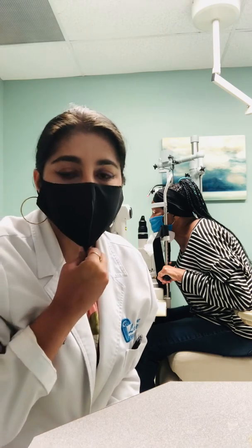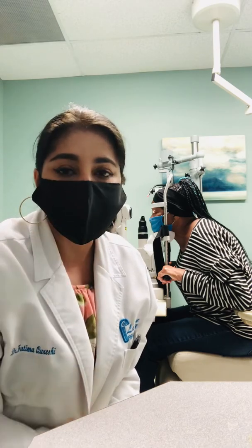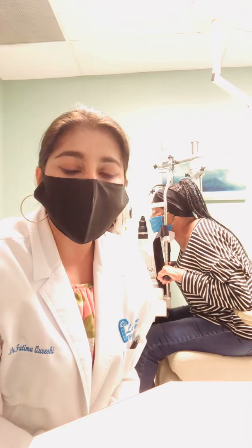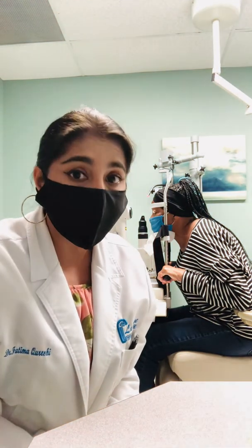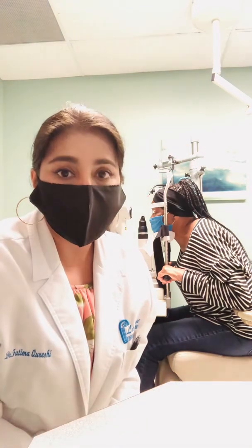This means I'm going to make a little hole in the iris so that the fluid can start draining. Then we see the patient again to make sure the pressures are under control. Sometimes you may still need to put them on glaucoma drops, but a lot of times the fluid drains very well because of the opening made with the laser.